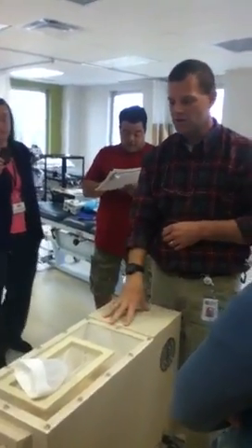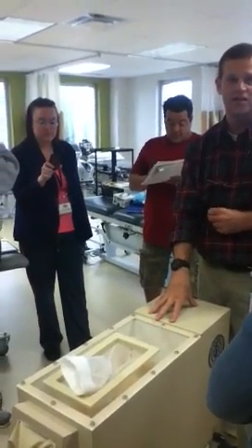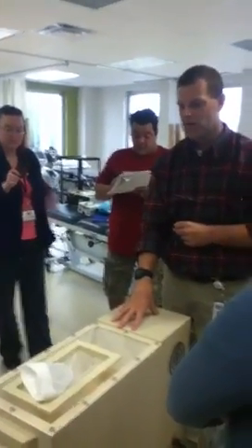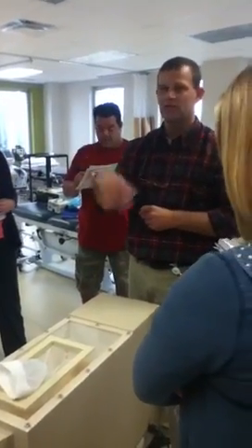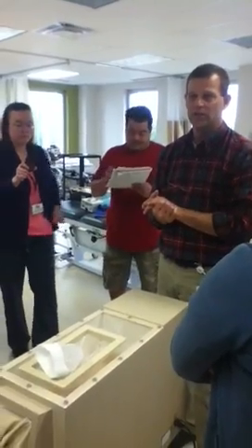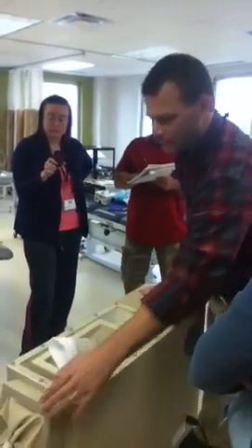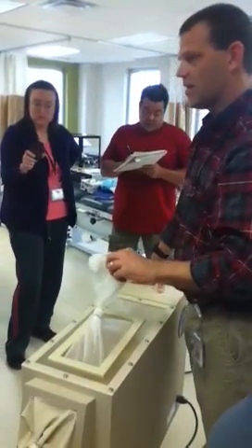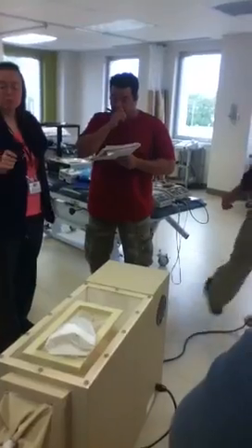The other time I use this is when a patient has like a hypersensitivity — we use it to try to desensitize things. So it's like putting your hand in a dry whirlpool. Same kinds of things you would use a whirlpool for, but you want to keep them dry. The other nice thing about this is I can put you in this one and then stick my hand in and reach in there and maybe stretch you while you're working.